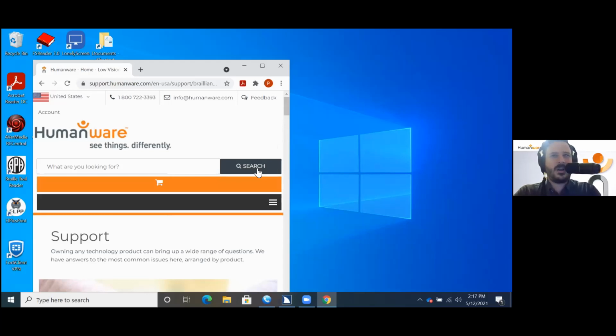So Mystic Access has done audio tutorials on many products. You can find them here. We can move through this by heading. We certainly will find our software and how-tos and all sorts of things. And what we want to do, though, is we're looking for our software link. You will also hear my 4-month-old screaming her head off in the background, so forgive me for that.